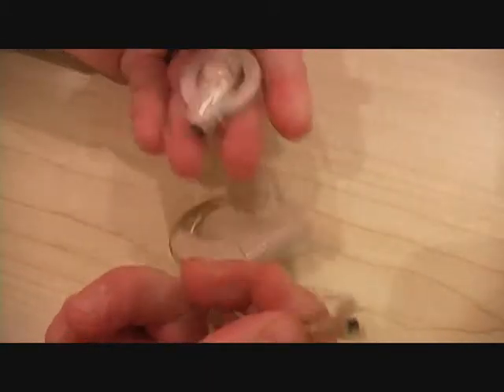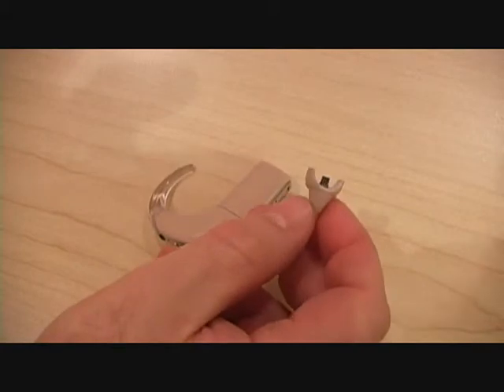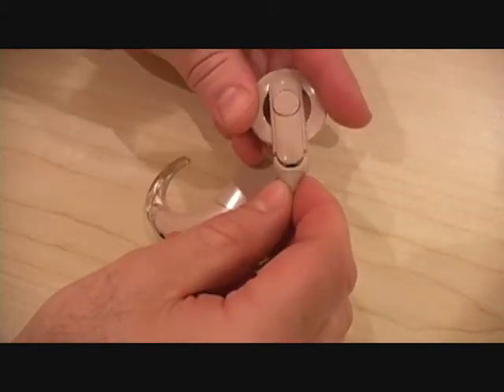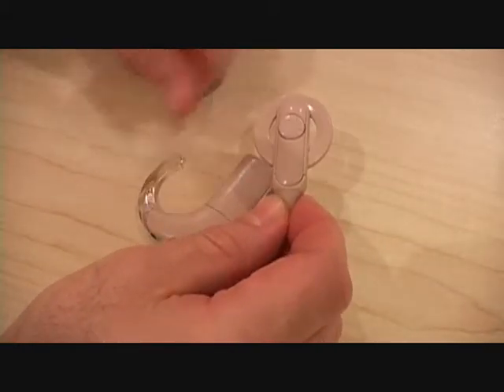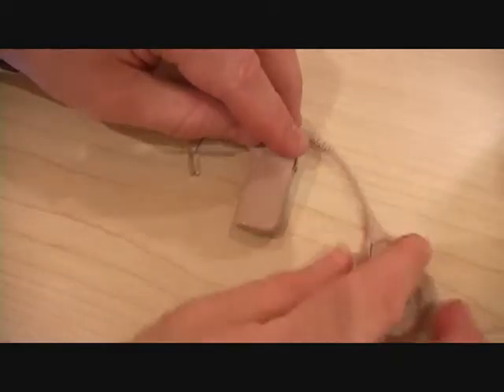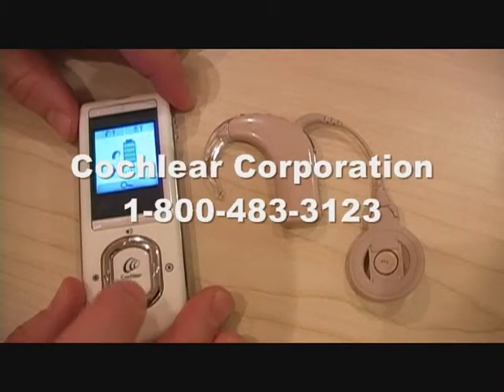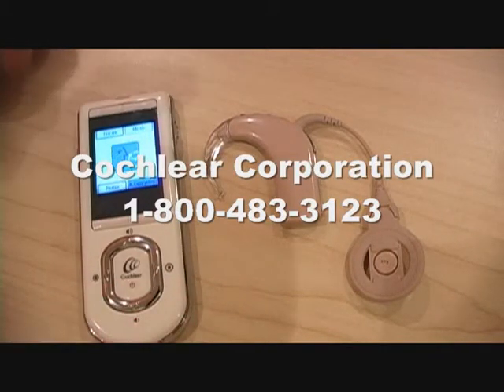To do this, pull the cable apart from the coil and replace it with a spare coil. If you continue to have no sound after replacing the cable and the coil, then you'll want to contact Cochlear at 1-800-483-3123.